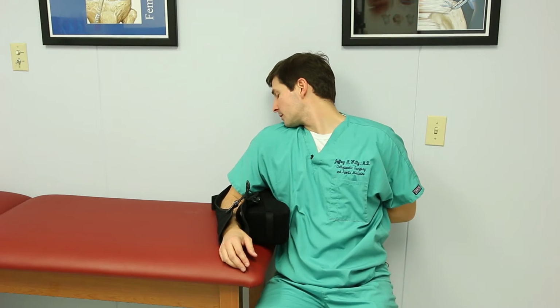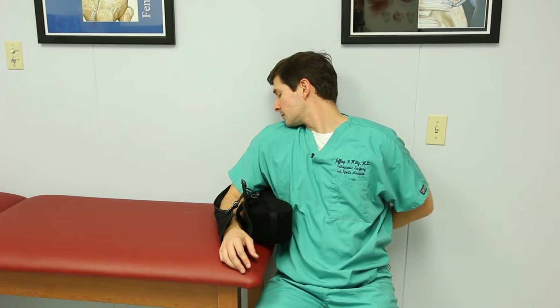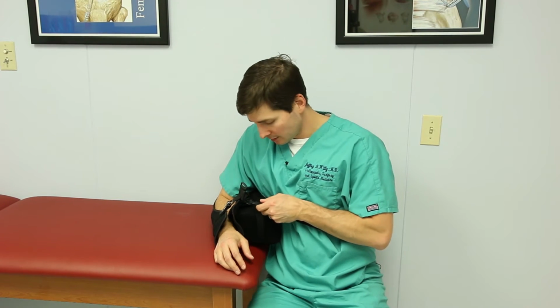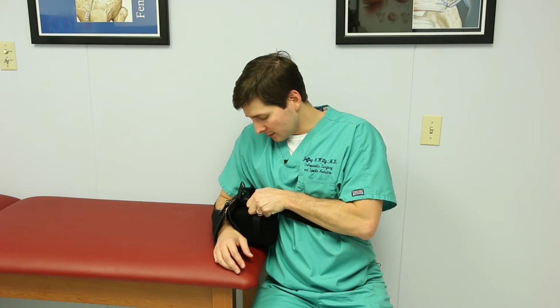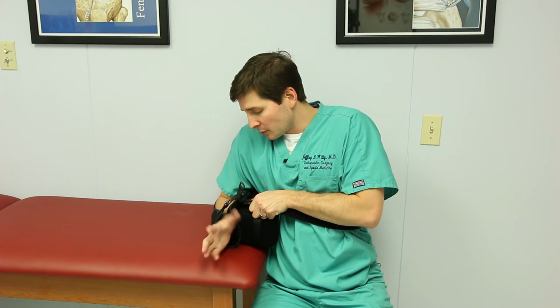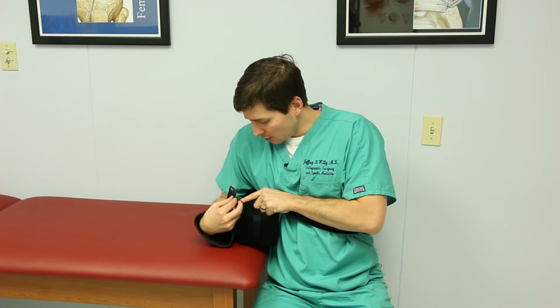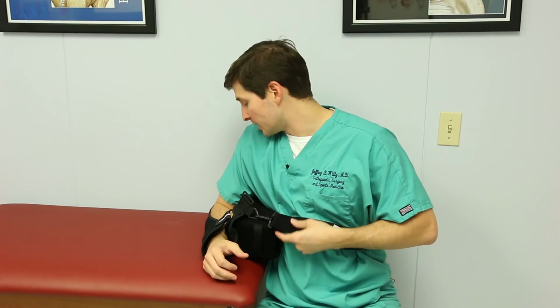Now the next step is we look behind us at the next strap, and we just reach this arm behind. And you can see I've got my clip right here. I can adjust the pillow with my uninjured side, and I can just clip it on. Now if you need to, you can reach up like this with your hand just to help out a little bit if things get a little tricky. Pull this up like this, and you can see I've got that clipped on pretty easy right there.